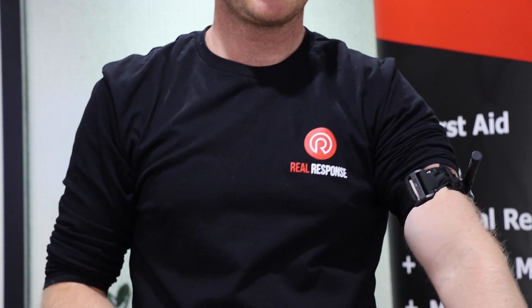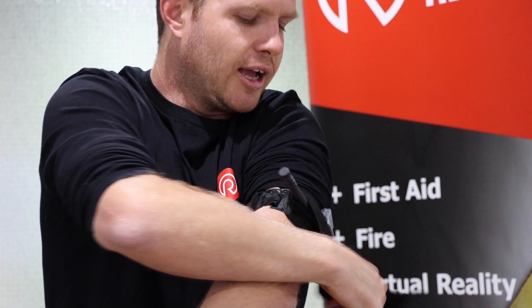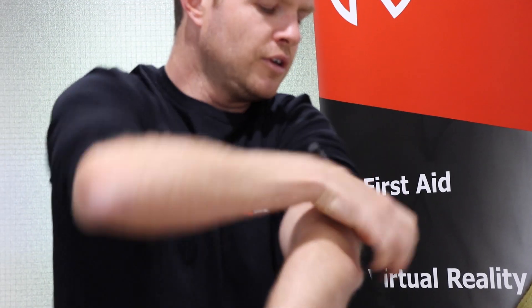Start twisting and then lock it off. It's going to be quite painful - there are a lot of muscles, nerves, and tissues that we're compressing, and it's going to be very uncomfortable for your patient. Once it's in place, quickly make sure that bleeding has stopped and they don't have a distal pulse if time and situation allow. Then lock everything in place, write the time, and continue with your blood sweep to check for any other bleeds.